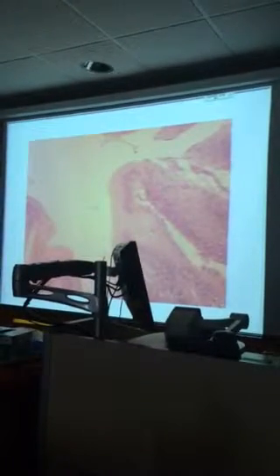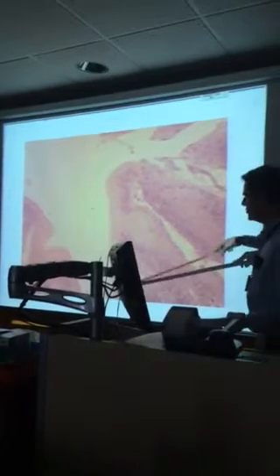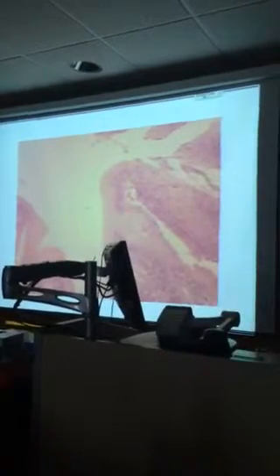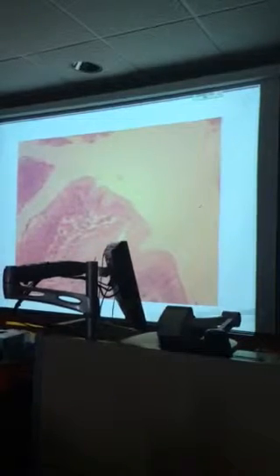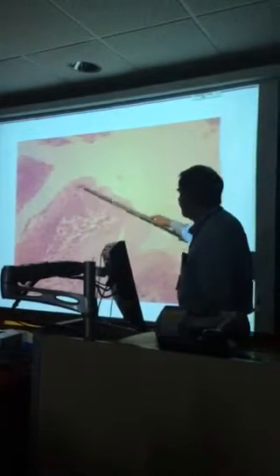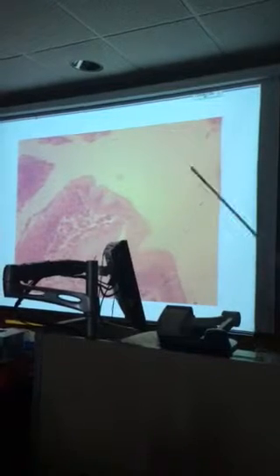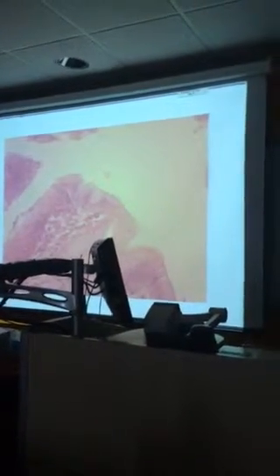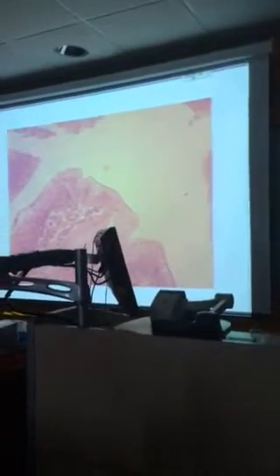Okay? So non-keratinized stratified squamous, simple columnar. Simple columnar, then you go up to the non-keratinized stratified squamous. Right up here. So that's a junction between the esophagus and the stomach. Okay, any questions on this? Okay, let's look at the stomach wall itself now.